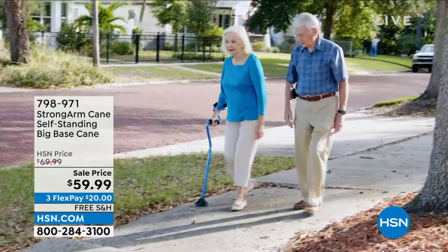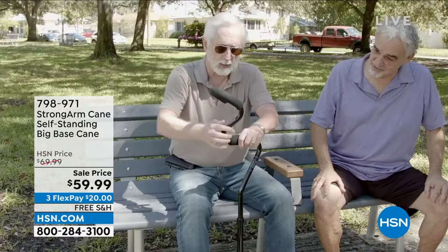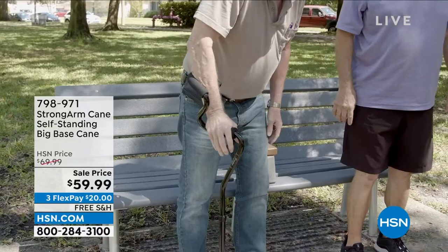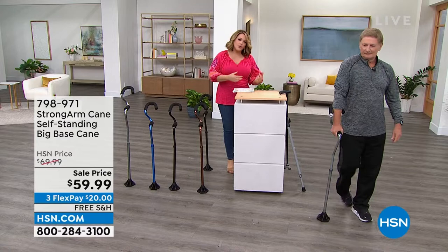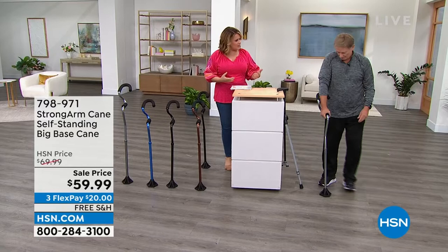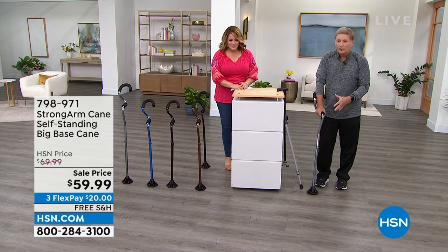It's been a best seller since we launched it, and now we're down to less than 2,000 — choose your color today. Sale price, only $20 to try it, and 30 days to love it or send it back. We've got titanium, blue, black, or bronze. People who were fiercely independent start getting insecure, not sure-footed, not confident with every step — this gives people their independence. With that wide base you'll move even faster than you normally would with a cane.